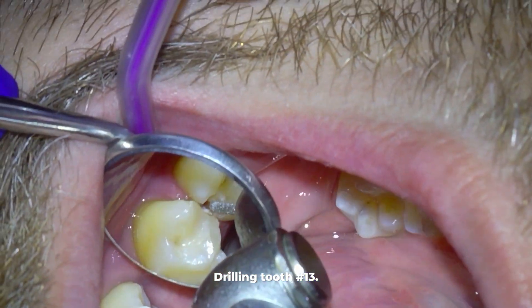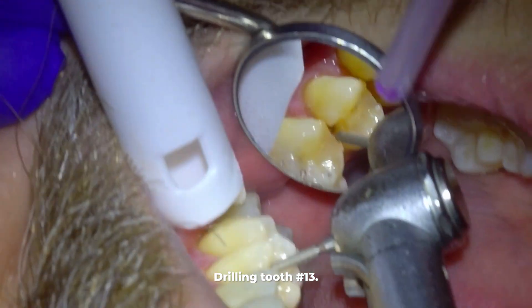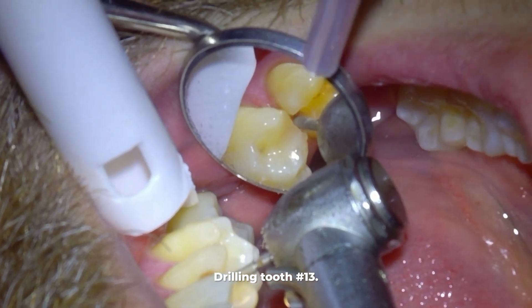Now we keep drilling the tooth with the high speed drill to make the ideal size slot for the filling. As I finish up, I will also remove the old filling with the void in it that I showed you in the x-ray earlier.